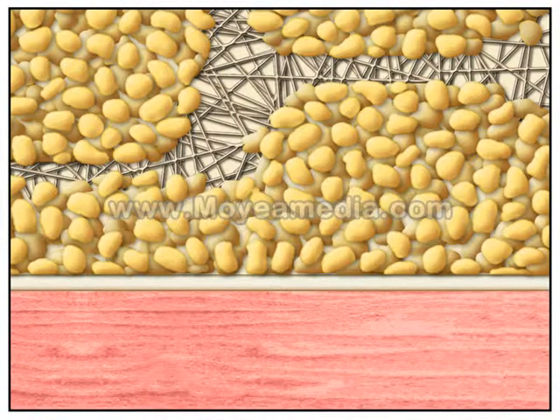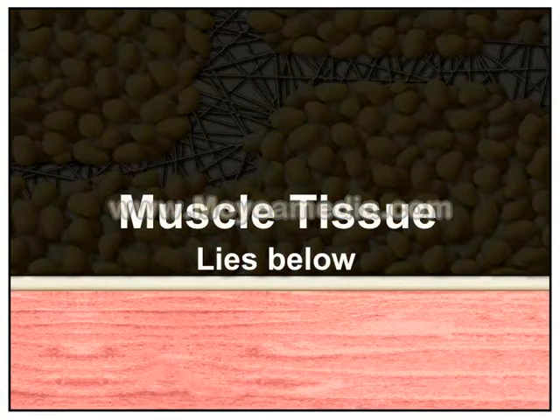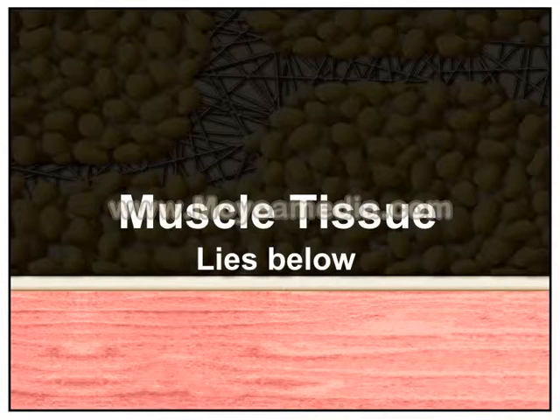So higher power shows the septae in between the lobules of lipocytes. The lobules of fat, when necrotic, are typical for a lobular panniculitis, whereas entities such as erythema nodosum that are septal panniculitis, not surprisingly, are localized to the septum. Below the subcutaneous fat is a layer of striated muscle, especially on areas such as the head and neck where SMAS muscle is visible.